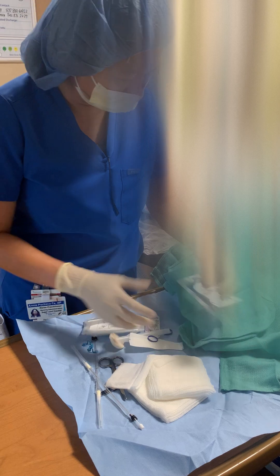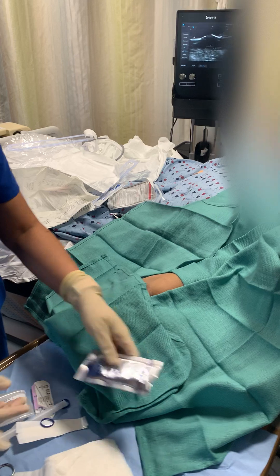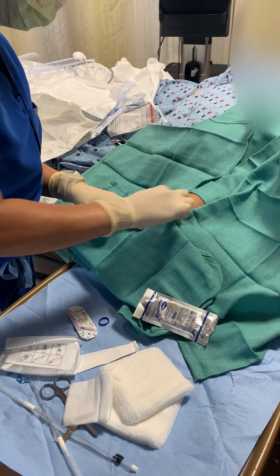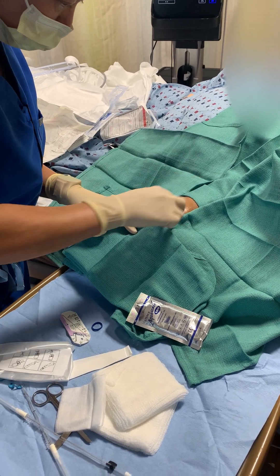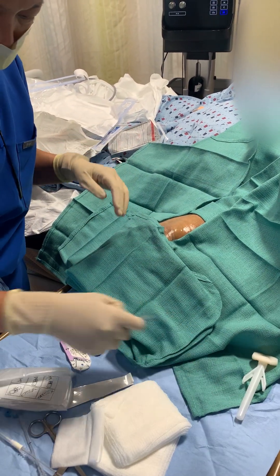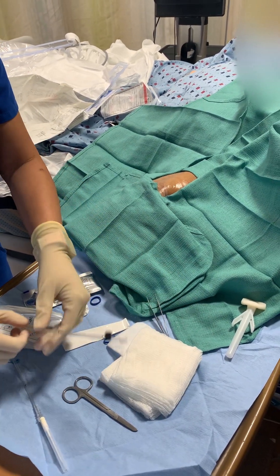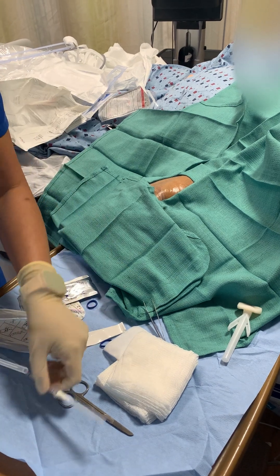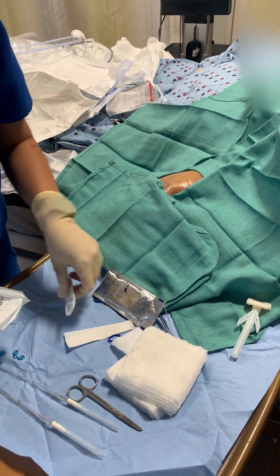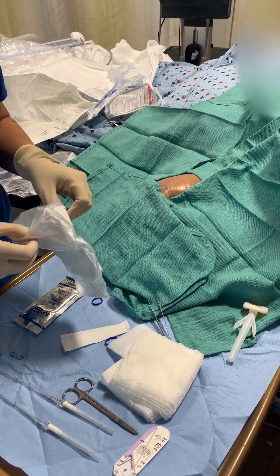We have draped the patient. Her artery should be here. We're going to show you via the ultrasound the difference — how you would know it's an artery. So I'm going to cleanse the area first, of course. Double cleansing. You have your four by fours. I have my scissor to cut the stitch and I have my two arterial catheters, my needle — a straight needle. This is your probe cover.